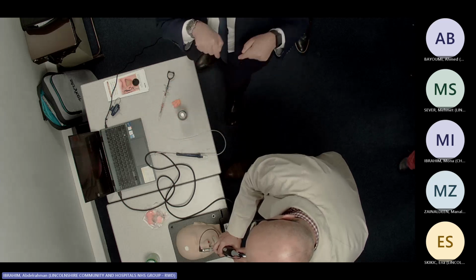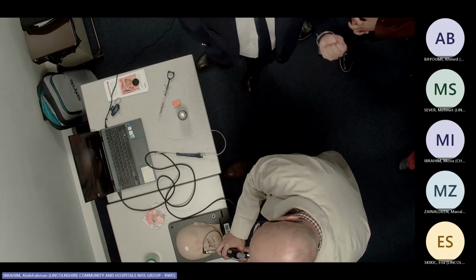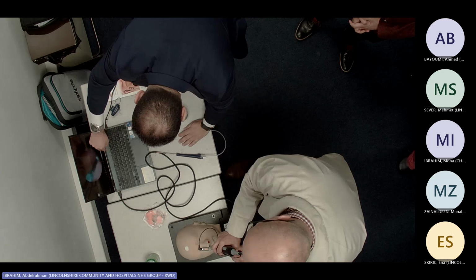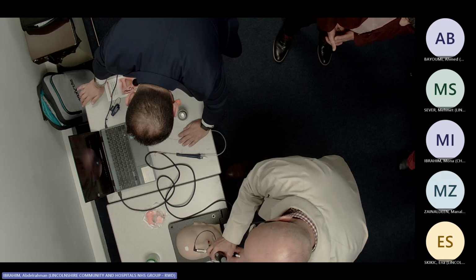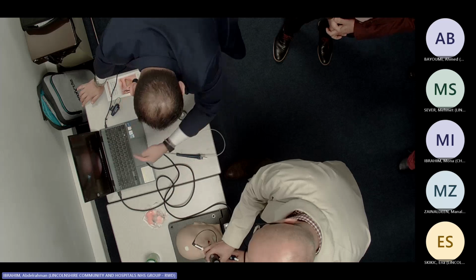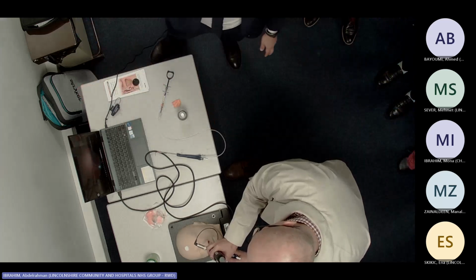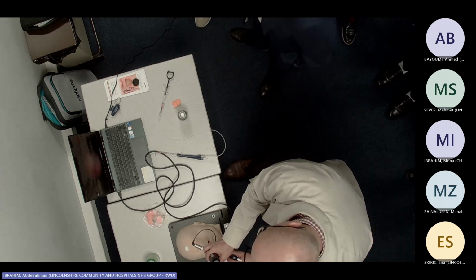The balloon. So you need to go back out again, and you need to be above the balloon. Yes. Okay. Sometimes you start to see the hooks hanging out. So just check there. Yeah, you can feel it. So what you're doing is you're just pressing down, just to make sure that it doesn't relax.